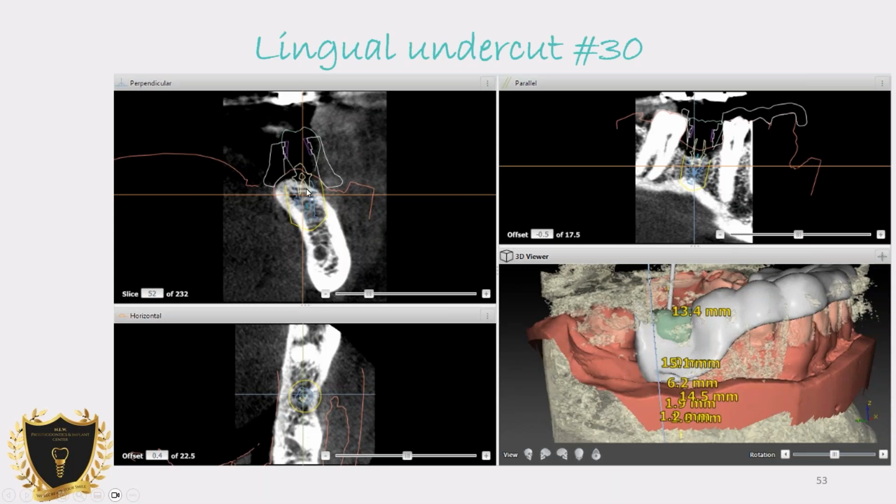And here, if we don't take this into account, you can easily perforate on the lingual. So this implant placement was very crucial. Guided placement was key in this particular one, because if you had looked at the two-dimensional X-ray, you would have placed an implant, because it looks like the IAN, or mandibular canal, is like 15 millimeters away from there. Then you would place an implant right over there and perforate the lingual. This way you can prevent that, plan it 100% perfectly, and execute properly. In this case, you will place a shorter implant to achieve an optimal result.